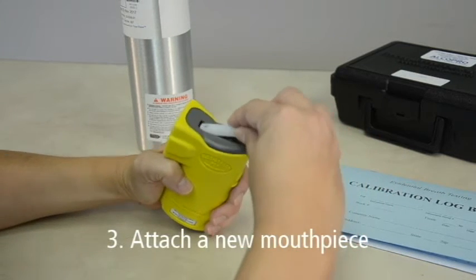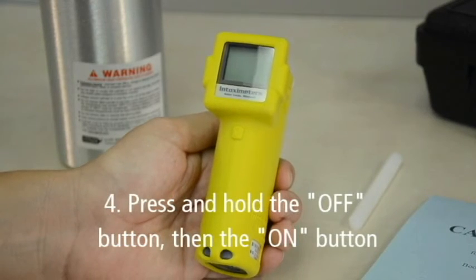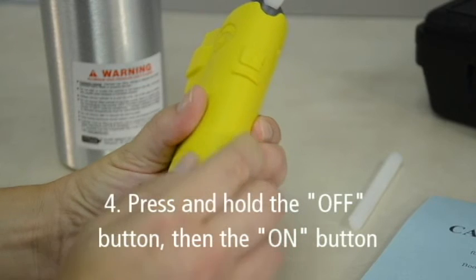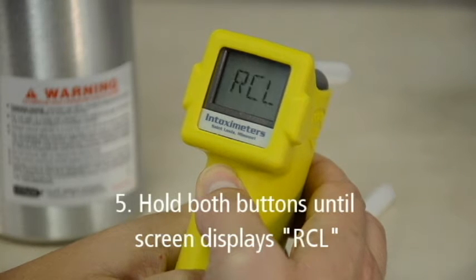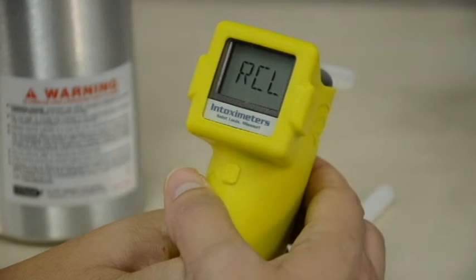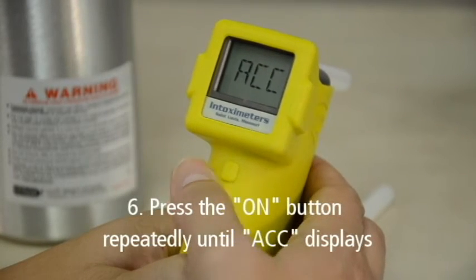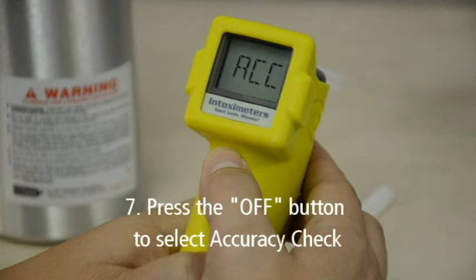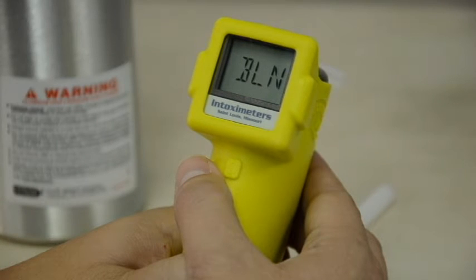Next, attach the new mouthpiece to the Alkosensor FST. To access the maintenance menu, first press the OFF button, located under the display screen, then press the ON button, which is located on the back of the instrument. Hold both buttons for a few seconds until the screen displays RCL. Put the FST device in accuracy check mode by pressing the ON button repeatedly until ACC displays on the screen, then press the OFF button once to select the accuracy check mode. The FST screen will display the temperature, then BLN for approximately 3 seconds.